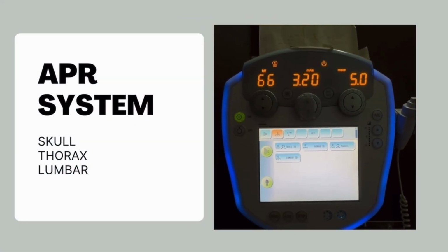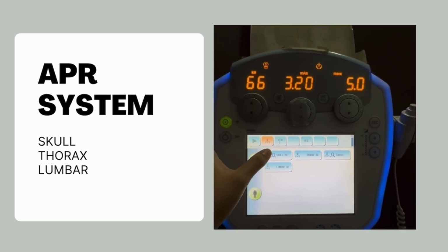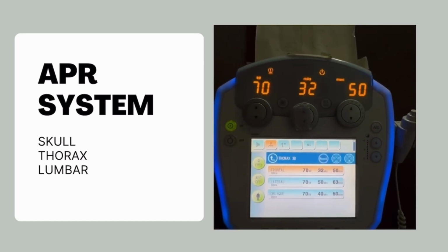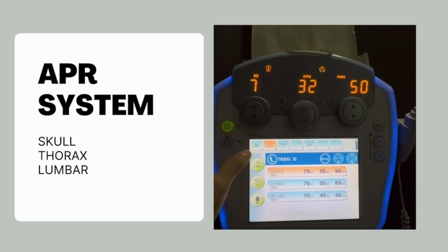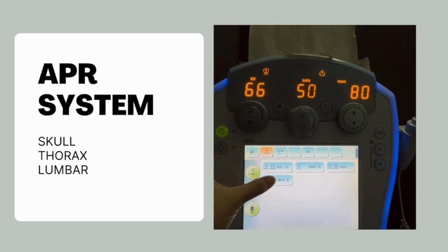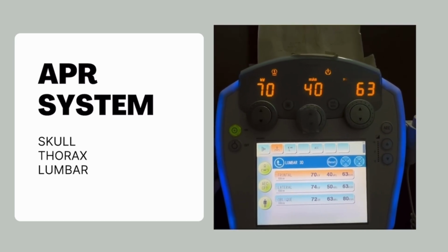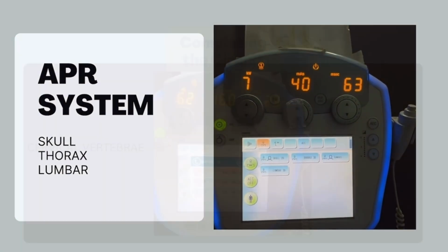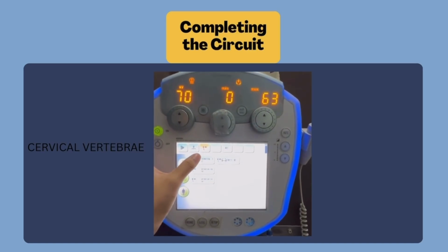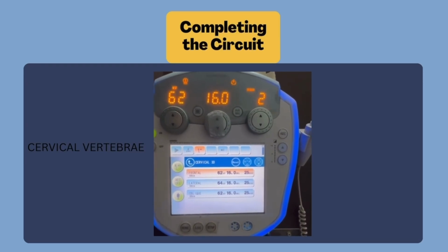After that, I want to share with you guys other projections for the anatomy of our body. Next, we have the skull, frontal and also lateral, thorax, frontal, lateral and also oblique, Towne's view, and lumbar view. For the lumbar, it also consists of the frontal, lateral and also oblique. Other than that, we can see that it also consists of the cervical vertebra. It consists of the frontal, lateral and also oblique.